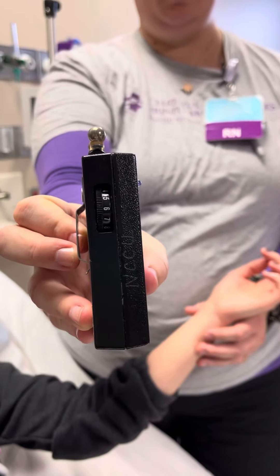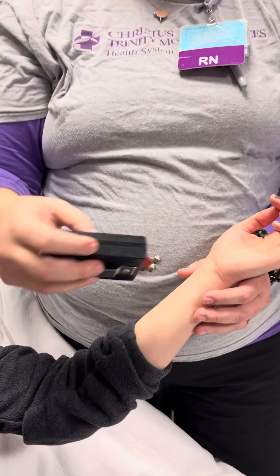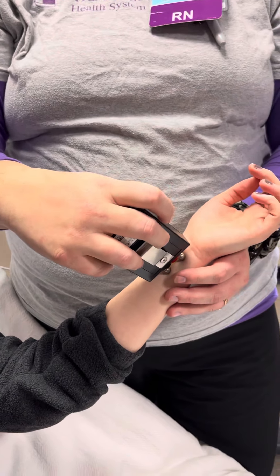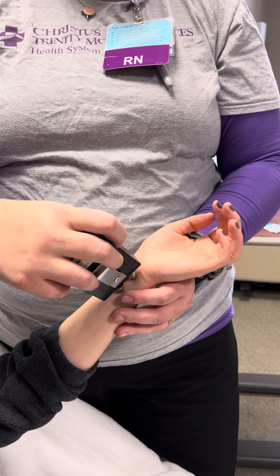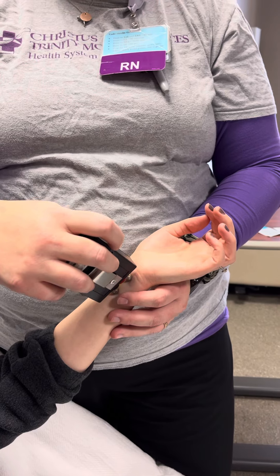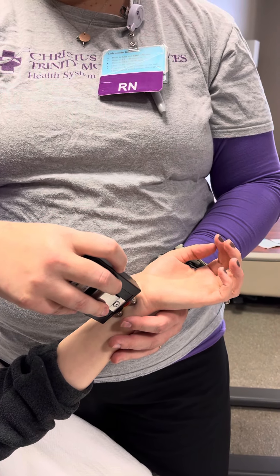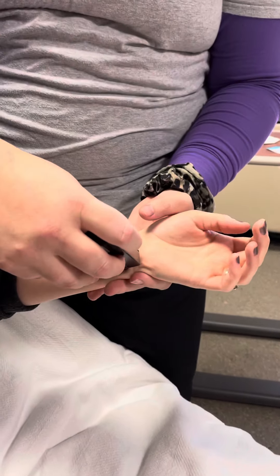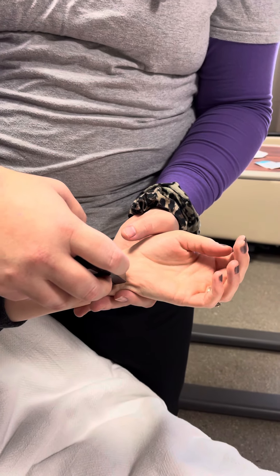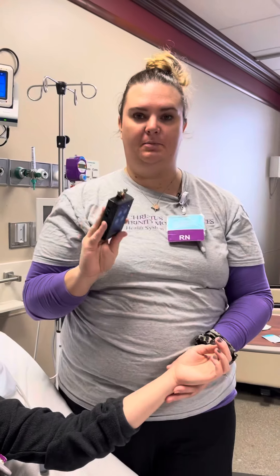If you don't know their baseline you would start at one and gradually work your way up until you see four out of four twitches. As you can see she had four out of four twitches on an amp of six.